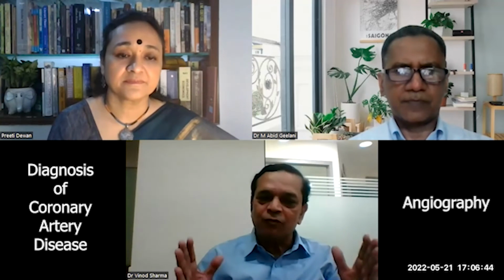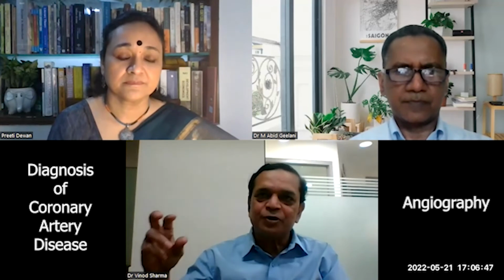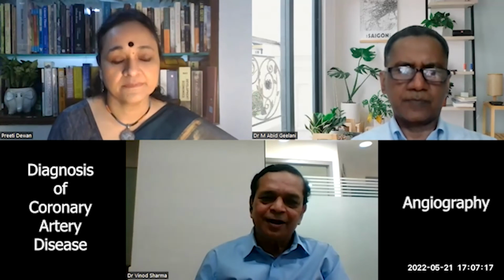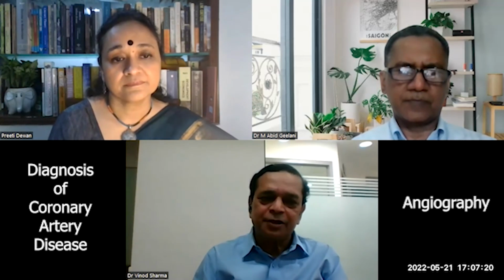It gives an idea about the wall. It gives an idea about the atherosclerotic deposit, whether it is soft plaque, whether it is hard, whether there is calcification, how much is the luminal narrowing. So no doubt CT angiography has a bit of an upper edge as far as the quantum of information which we obtain is concerned. But as of today, in conventional practice, conventional coronary angiography is still taken as the gold standard. But as I said, it is just a luminogram. We are just seeing the lumen, not the wall. And to treat the atherosclerosis in totality, we need to see both wall and lumen.